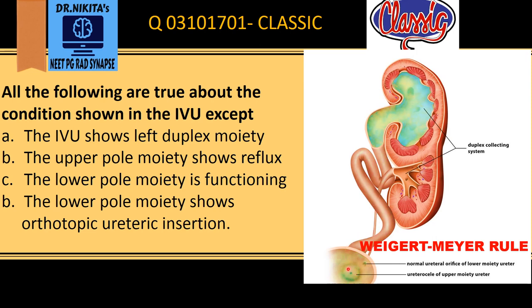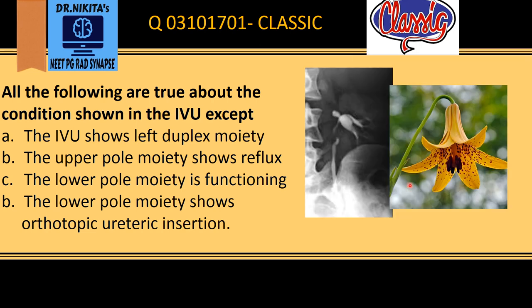The upper pole ureter moiety has a ureterocele, because of which this upper pole is obstructed, while the lower pole moiety shows reflux. Since this upper pole moiety is obstructed and enlarged, it does not opacify on the IVP. However, because it is enlarged, it exerts pressure on the lower pole moiety.